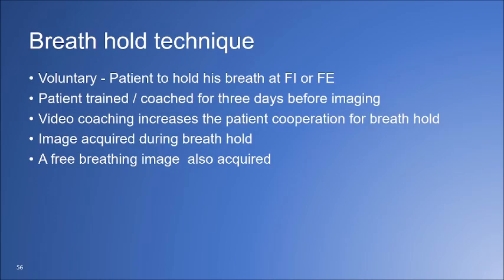In the breath hold technique, the patient is voluntarily expected to hold the breath either at full inspiration or expiration. The patient is trained and coached for a few days. In Vellore, when we started, we said we should first coach the patient for 3 days on how to do the breath hold. We had a video coaching and it actually increased the cooperation of the patient.